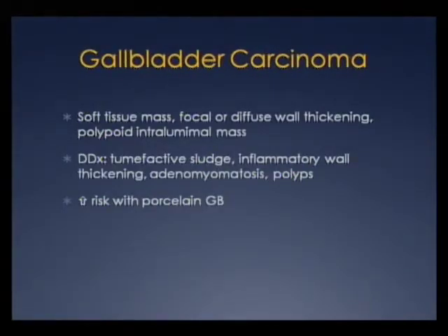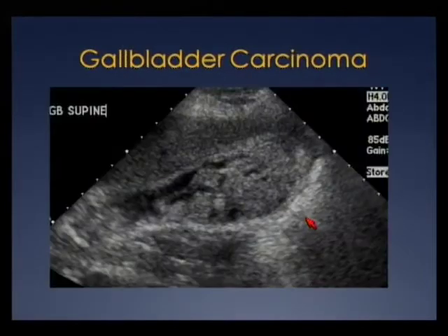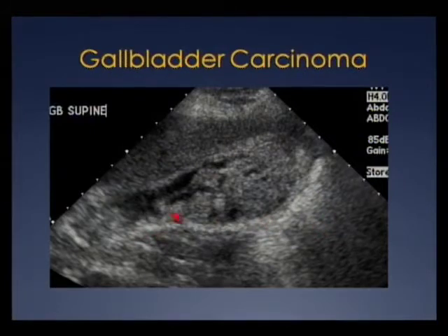Gallbladder carcinoma is uncommon and can have variable appearance — focal soft tissue mass, focal or diffuse wall thickening, or polypoid intraluminal mass. Tumefactive sludge, adenomyomatosis, and polyps can mimic it, and there is increased risk with porcelain gallbladder. Here's a patient with a large intraluminal mass filling the gallbladder — this is gallbladder carcinoma.